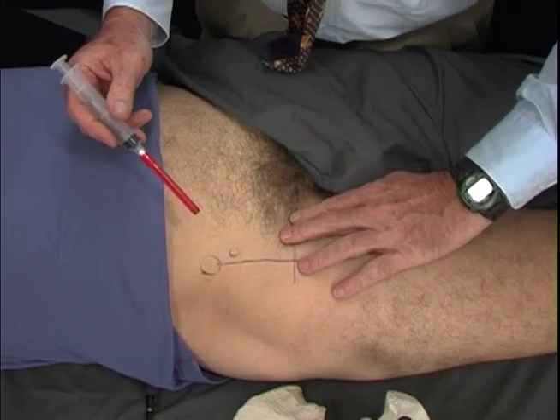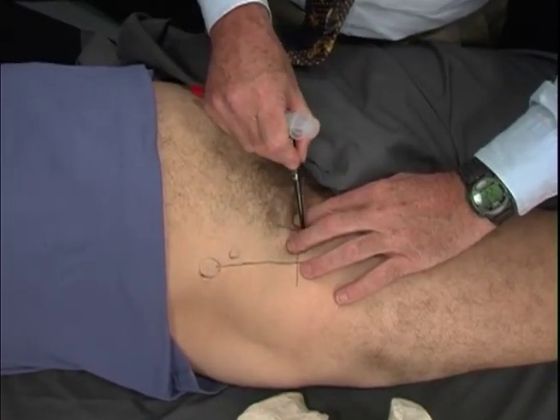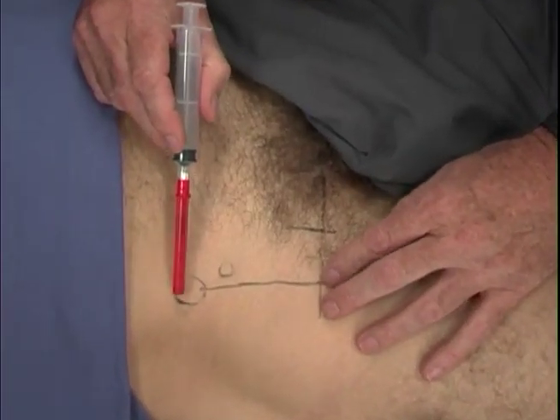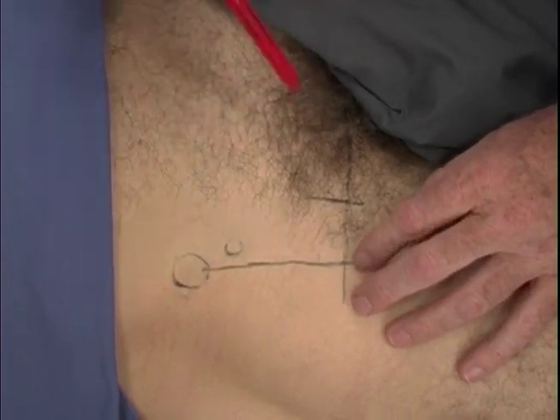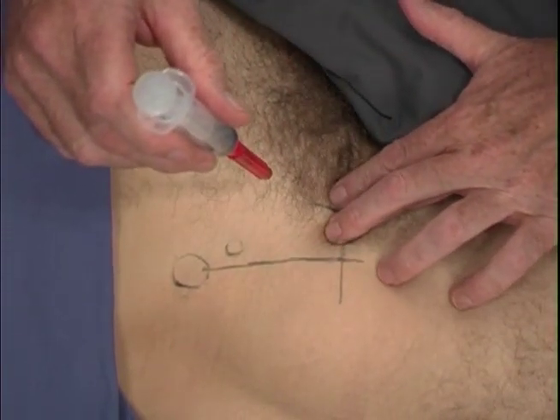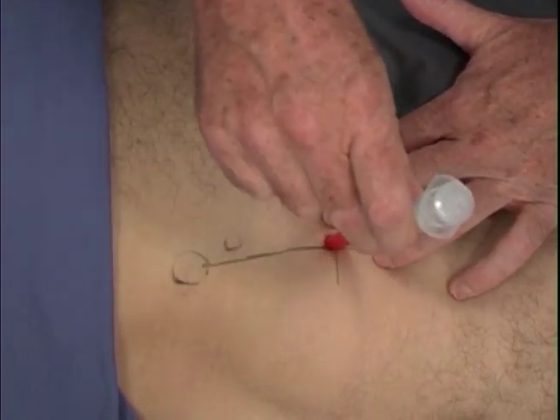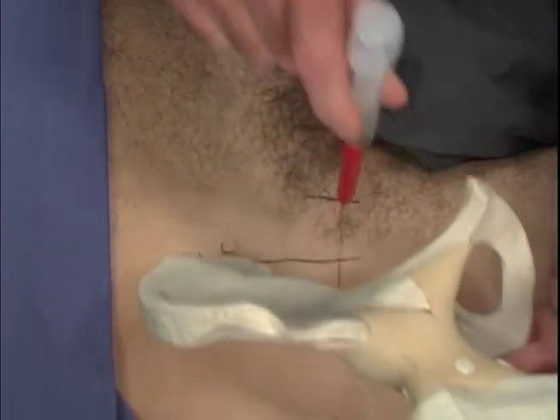We then feel the artery, which we can feel right here, and we know from our markings down from the anterior superior spine and in line with this that we want to avoid the artery, and so we come lateral to that and come in this direction toward the midline of the body.